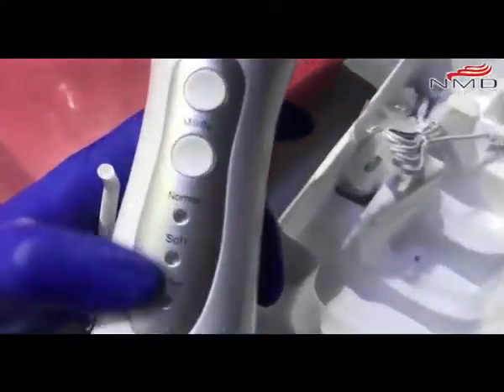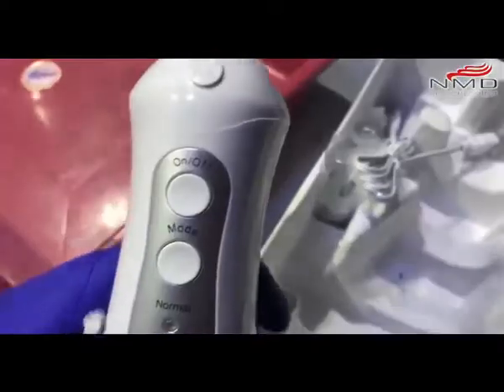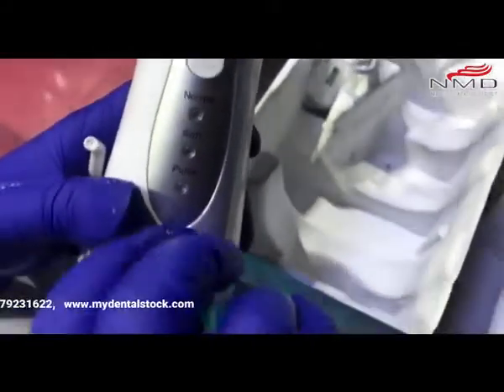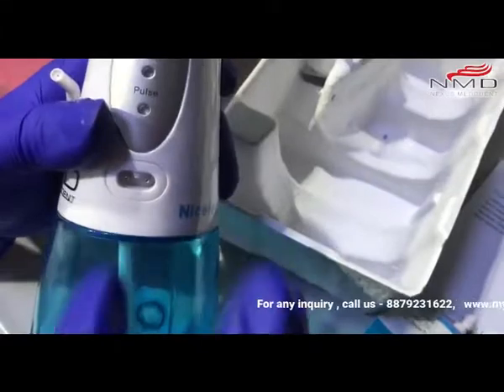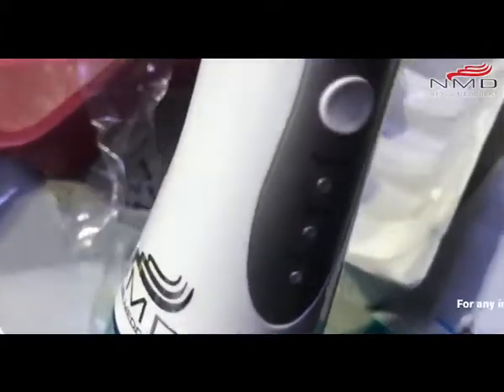The three modes are Normal, Soft, and Pulse. This is the on/off button. You just have to pull this and there is a plug-in — you can plug your batteries here.